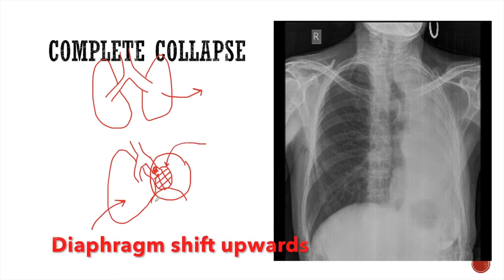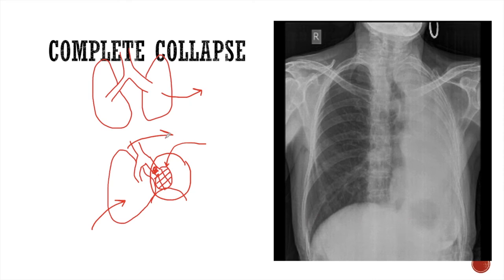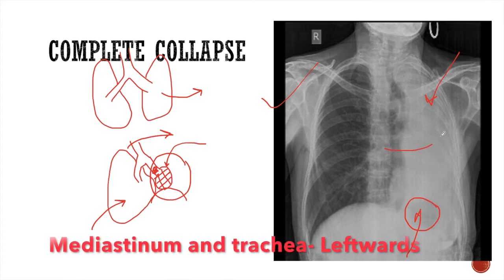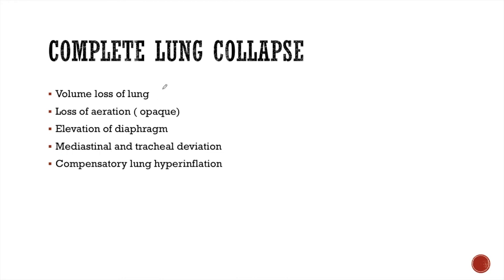When the volume of the lung decreases, the diaphragm shifts upwards. The mediastinum and trachea shift towards the collapsed side to compensate for the volume loss. This is what is seen in this x-ray — the left lung has completely collapsed and is no longer aerated. The left diaphragm is shifted upwards and the gas bubble of the stomach is shifted upwards. The mediastinum and trachea have shifted towards the left side. The collapsed lung appears completely opaque. In complete lung collapse, we will see volume loss, opacity due to loss of aeration, elevation of the diaphragm on the same side, mediastinal and tracheal deviation towards the same side, and hyperinflation of the opposite lung.